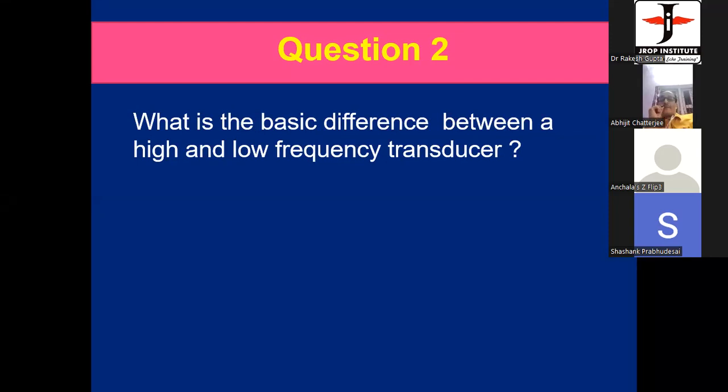You are right, but tell me something. You have an adult person. Do you want to use a high frequency transducer? Low frequency, sir. Why do you want to use a low frequency transducer? Because we want to go more deeply. Better penetration, sir.